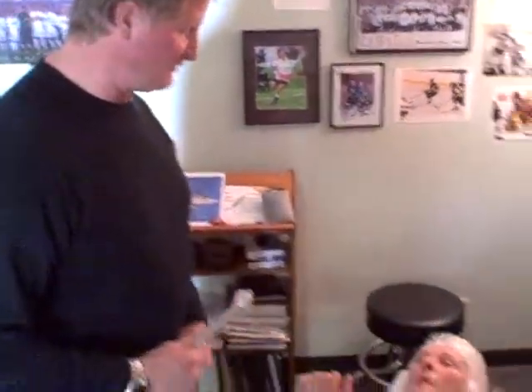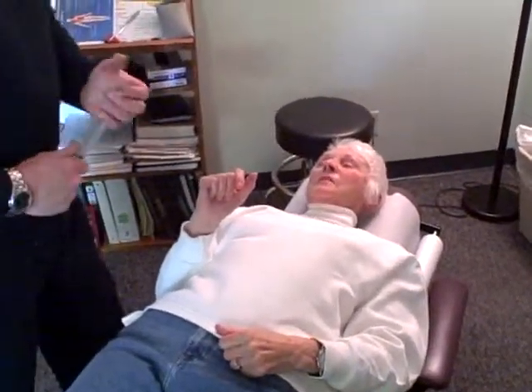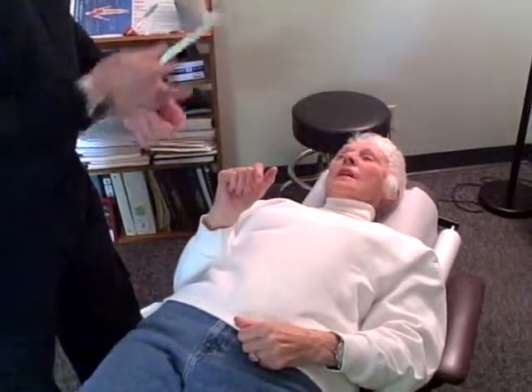By putting a very specific frequency to activate specific neurons in your brain, your arm has gotten stronger. Someday you'll be buying something that will actually help you out too. But that worked pretty good, didn't it?